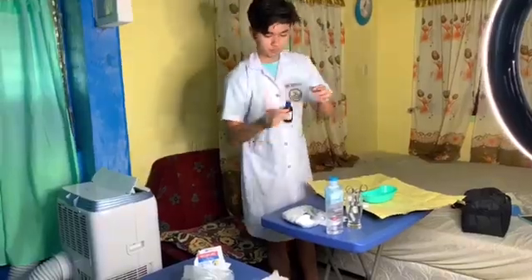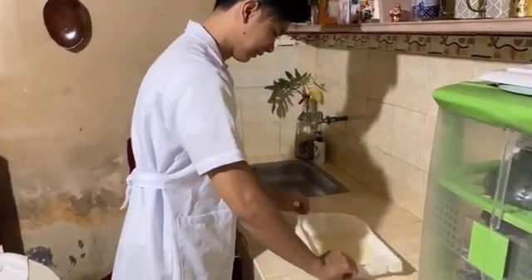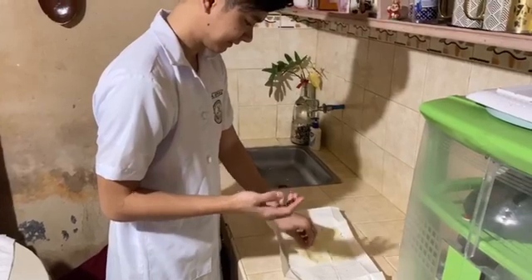Then, after that, don sterile gloves. Using sterile gloves prevents contaminating sterile equipment and introducing microorganisms within the wound.